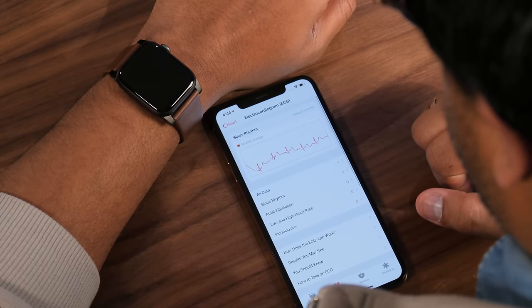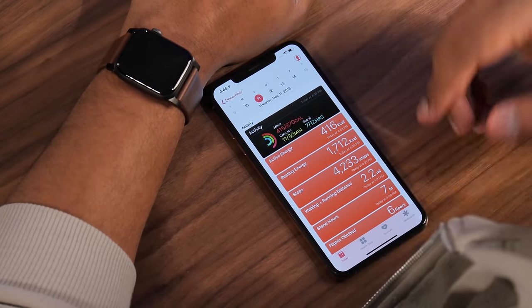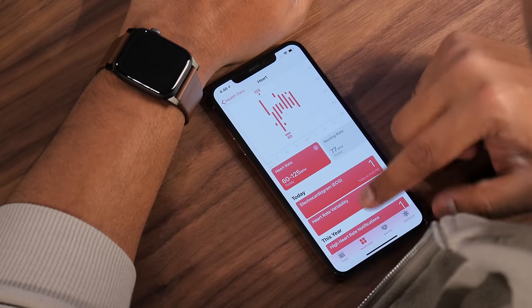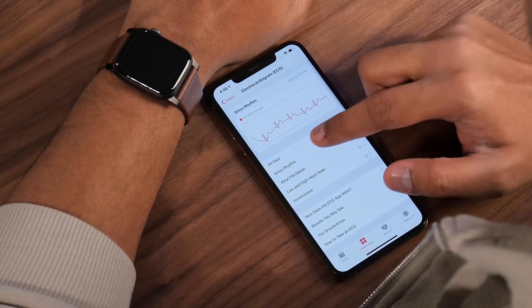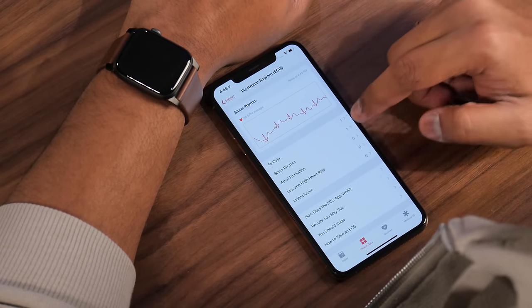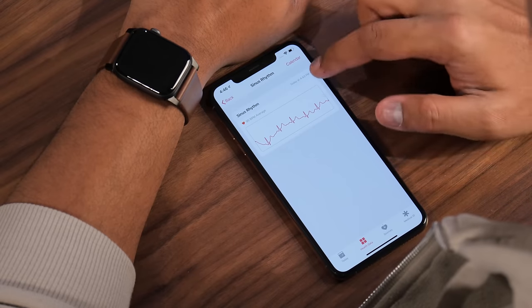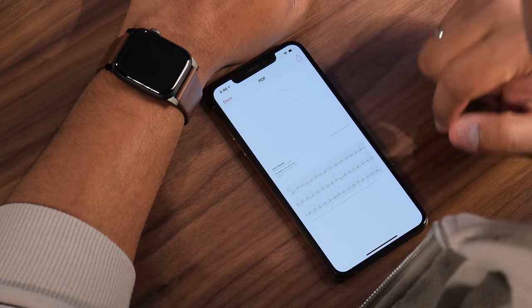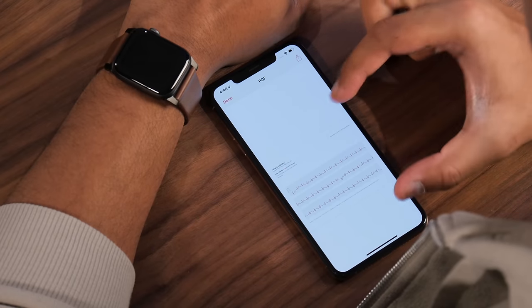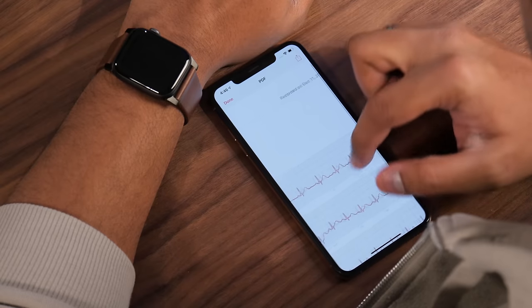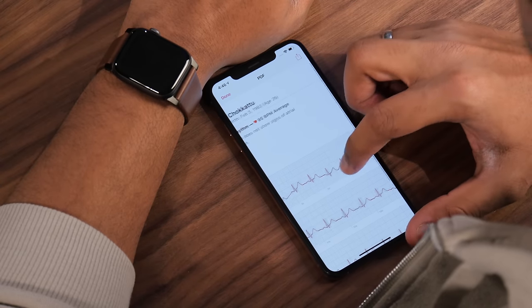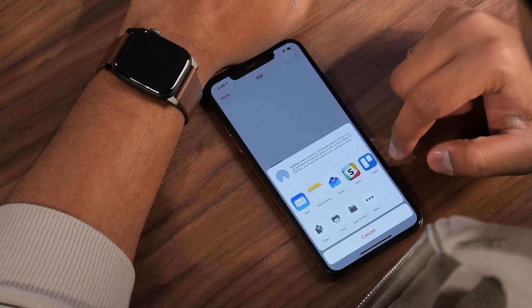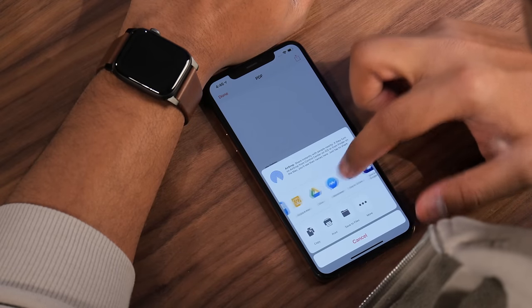Here's how to export that data to your physician. Go to the Health app, tap Health Data, then tap on Electrocardiogram. You can see all data or the sinus rhythm result we just got. Tap on it and you'll see the sinus rhythm reading; tap again and it says export a PDF for your doctor. It's shown to you in PDF form — typically what doctors see when they do an electrocardiogram in a hospital. You can export that data using your email or whatever app you have.